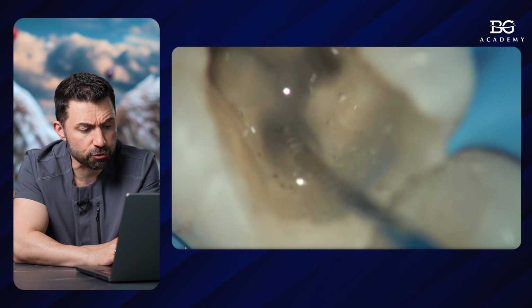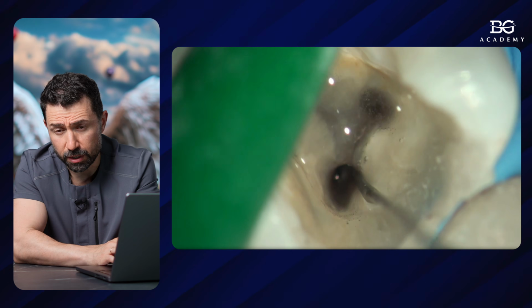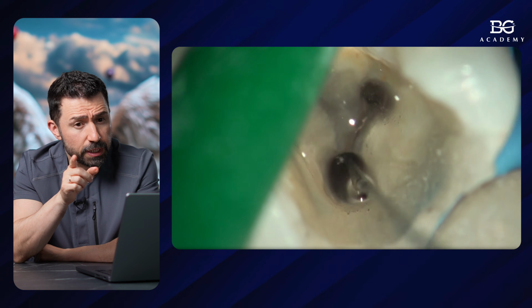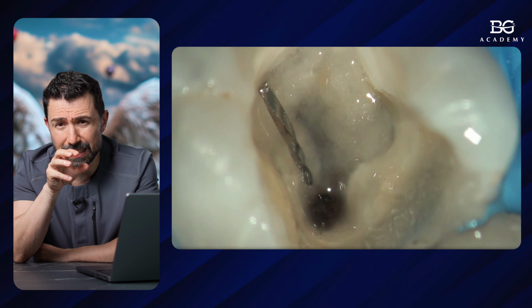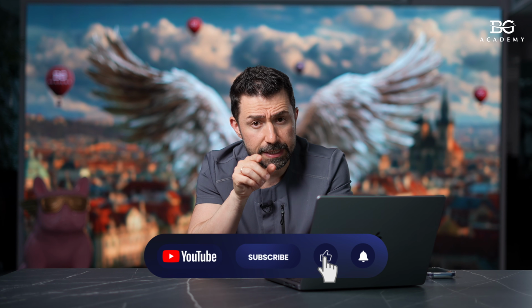I hope this trick will help you to become better in endo, and the broken file retrieval will become safer. You have to think about safe zones, you have to think about the access, and cutting the dentin in the direction where you are really safe to do that.